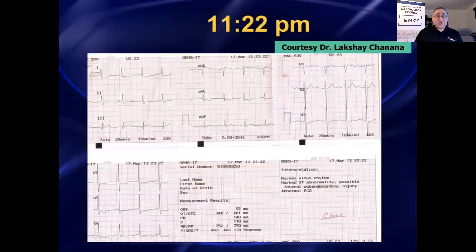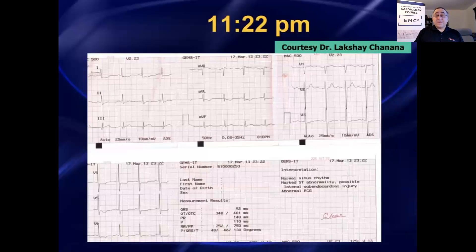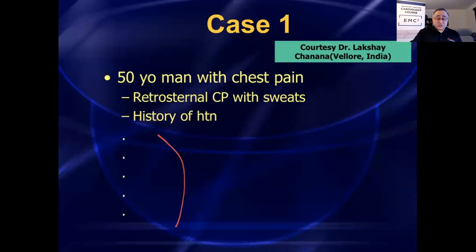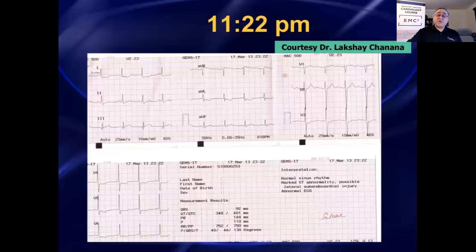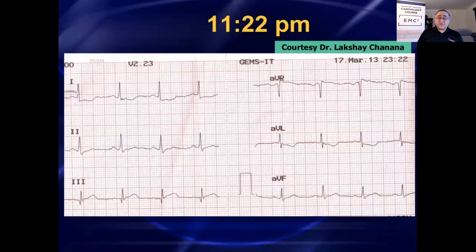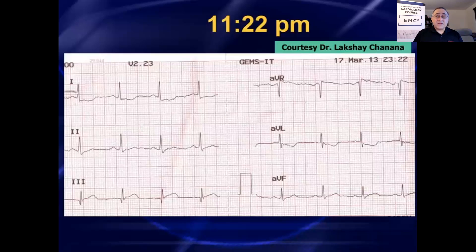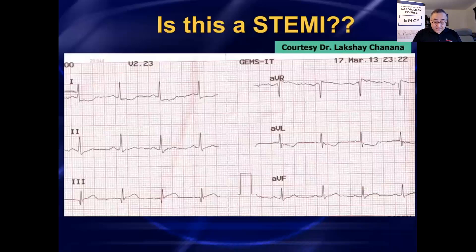If he decides this patient needs acute reperfusion therapy — in other words, lytics, they use streptokinase — so as you look at this 12-lead, the question is: would you give this patient thrombolytics? The leads that were most concerning were the inferior leads, so I'm going to blow those up for you. Looking at these inferior leads, my question is: would you give the patient thrombolytics? Do you think this patient qualifies as a STEMI?